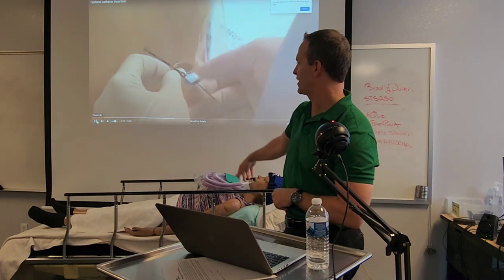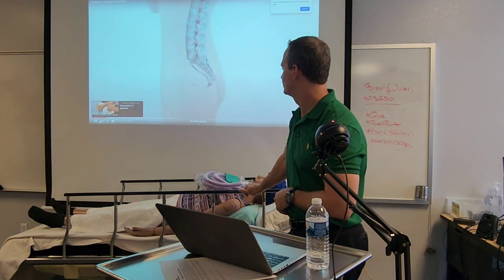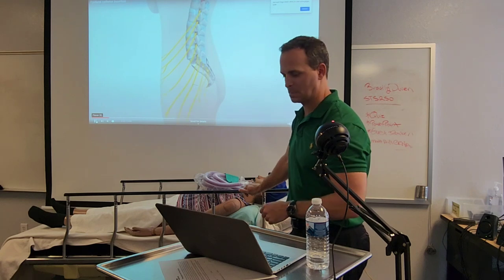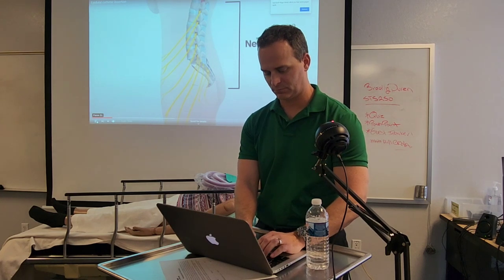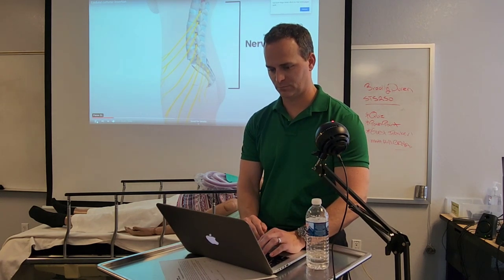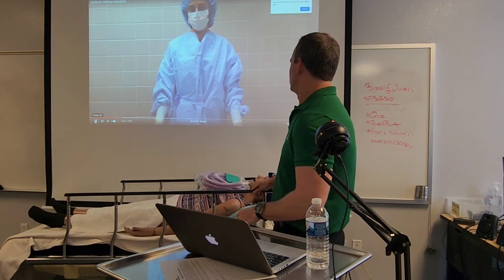Placement technique. Then they thread their catheter. Placement of a catheter in the lumbar epidural space allows one to administer analgesic and local anesthetic agents to a series of dorsal and ventral nerve roots that exit the spinal cord and traverse the epidural space, thereby providing anesthesia or analgesia to specific nerve root distributions. Sterile technique is very important for this procedure. Don a mask, head covering, and sterile gloves.